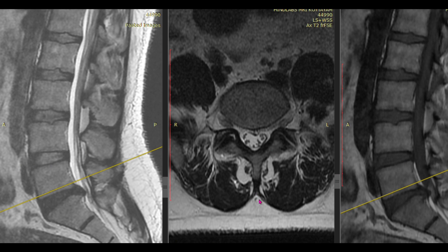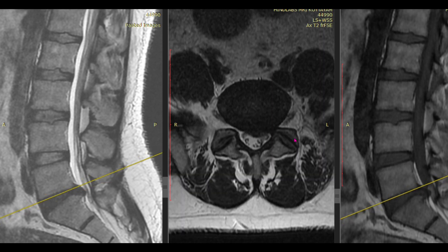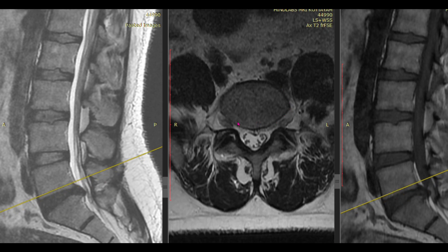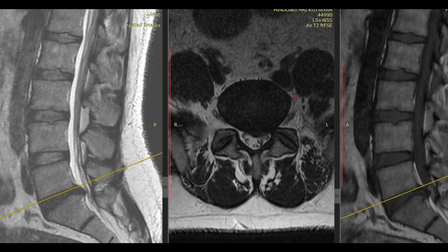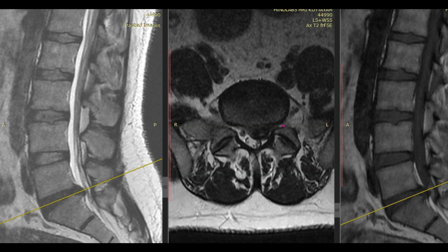This is the important level — the reason I selected this case is to teach you two things: how to identify a focal bulge and how to report it. Here you can see the disc margins almost correspond to the vertebral body margins except for the posterior part. When you see a disc bulge like this, it is a focal bulge arising from the posterior aspect of the disc.